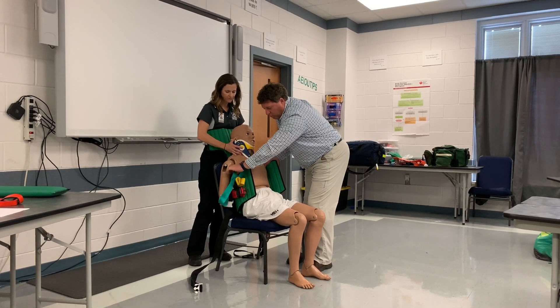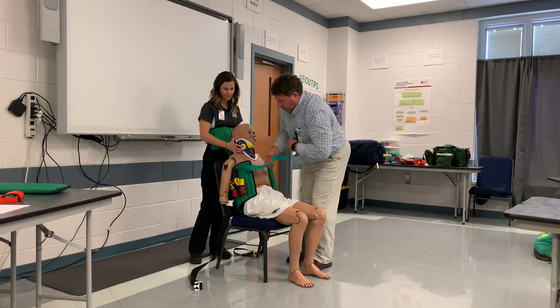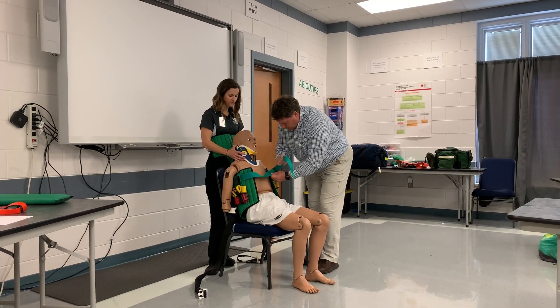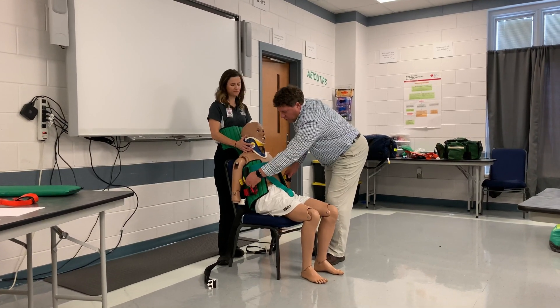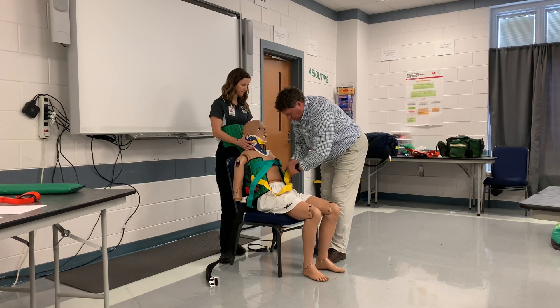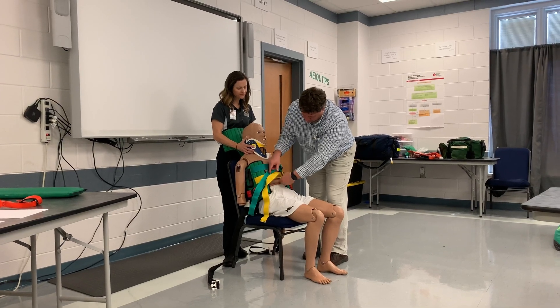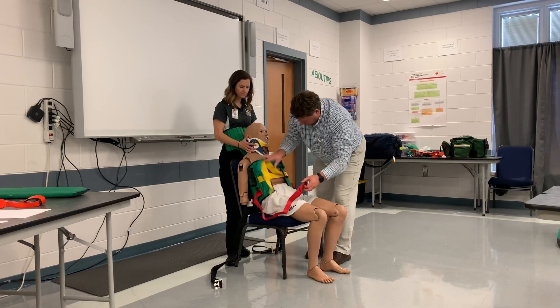I'm going to do my top strap just to kind of get it out of the way, but I'm not going to secure it real tightly yet because this could interfere with their respirations. So there's still some room in there and it's up pretty tight. My middle strap I can do a little bit snugger. When I get it down here, I don't want to jerk the patient by yanking on that - I feed it through, grab that strap, push it towards the buckle, and feed it in there. That's pretty snug, then I do the same thing for my bottom strap.